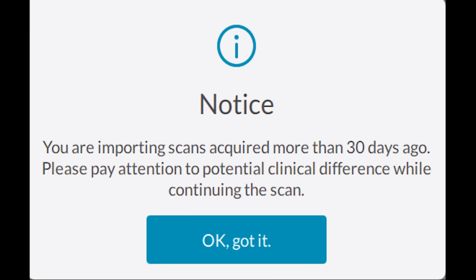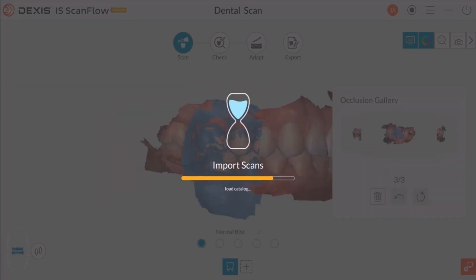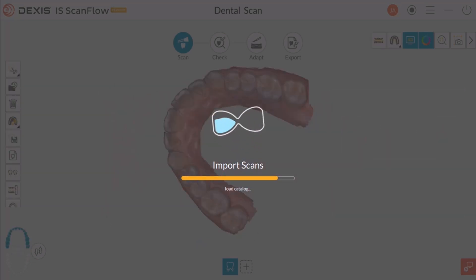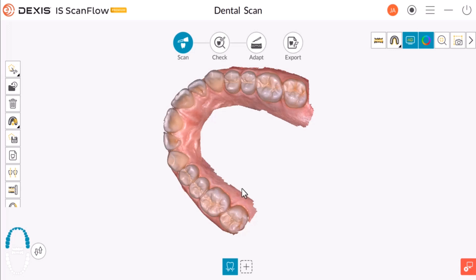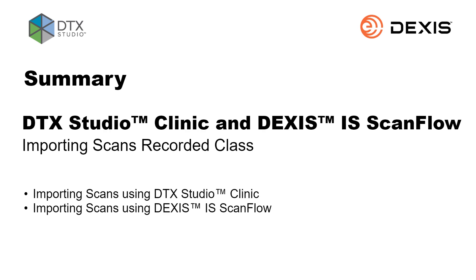If the window Notice — scans acquired more than 30 days — pops up, select OK, got it. The imported scan is displayed in the software. This concludes how to import scans into DEXIS IS ScanFlow within the DTX Studio integration.